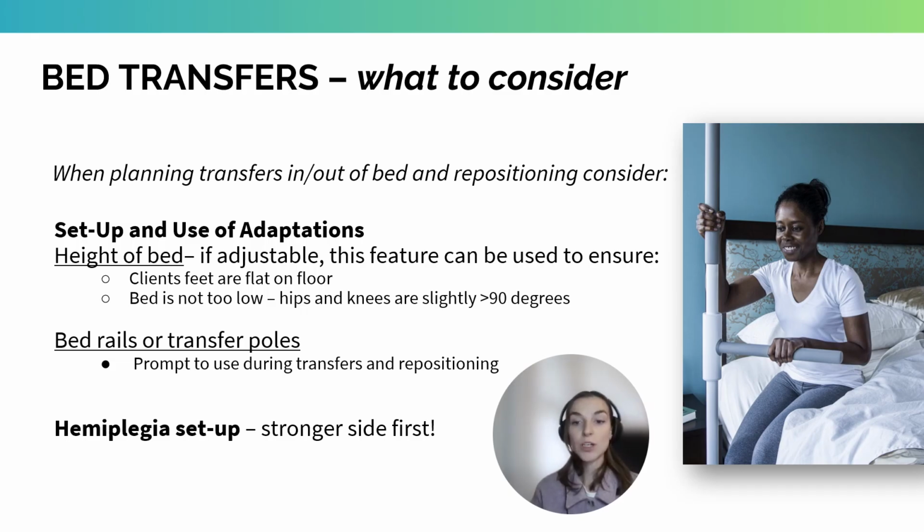Next, you're going to be watching a video that demonstrates how to support a client using a wheelchair to set up for their bed transfer. Please take a moment to watch the video now.